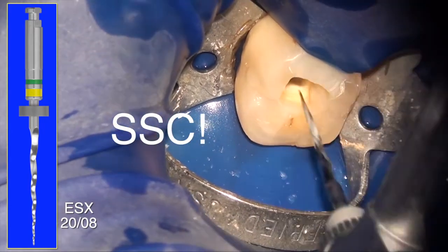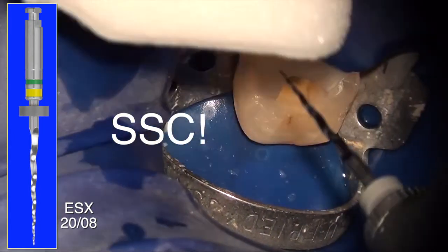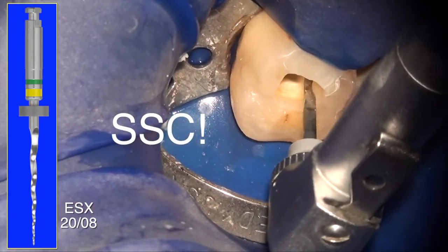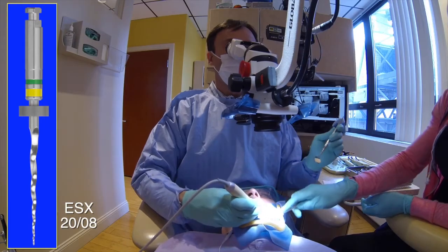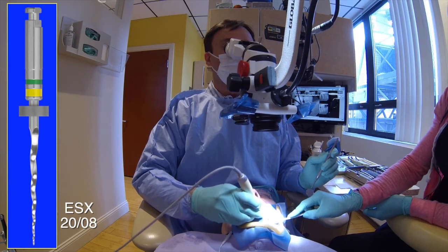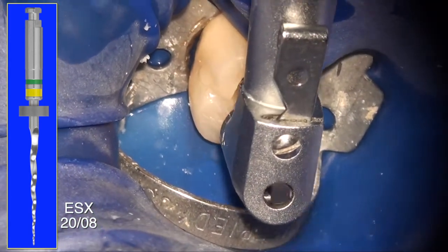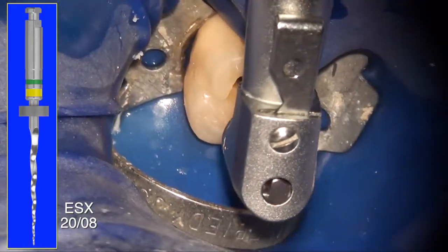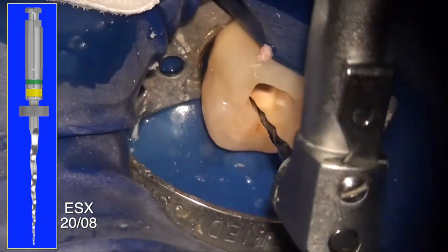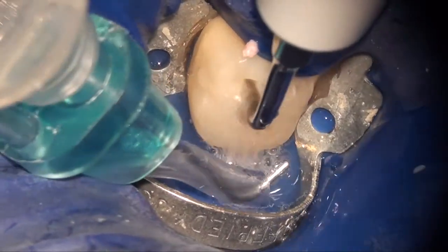So I noted that, and now I'm just using the orifice opener here, using SSC, and we're using the Real Endo brush here to, as you can see, my assistant here is just kind of brushing it off. I am taking single strokes, and then she is removing the debris from the flutes of the file. It's a significant thing. SSC is a very important component of using the ESX.